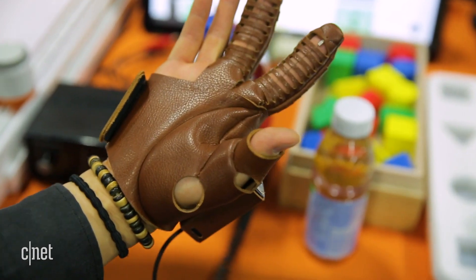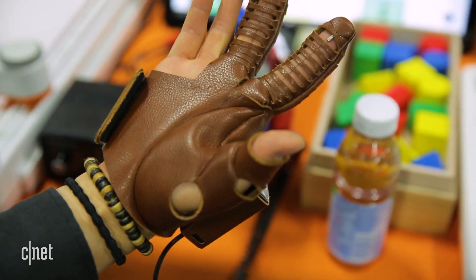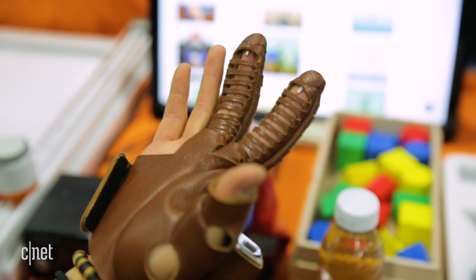Neofect, the company that makes the Neomono, is going to be having a Kickstarter later this year and they're hoping to have it out by the end of the year.